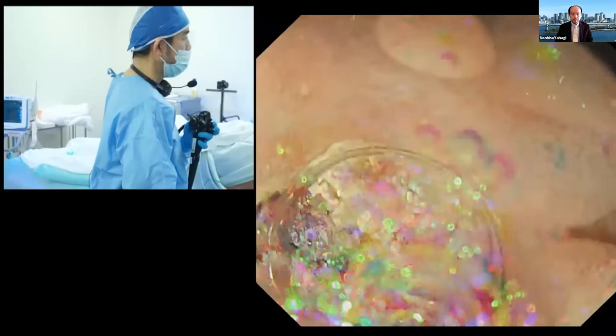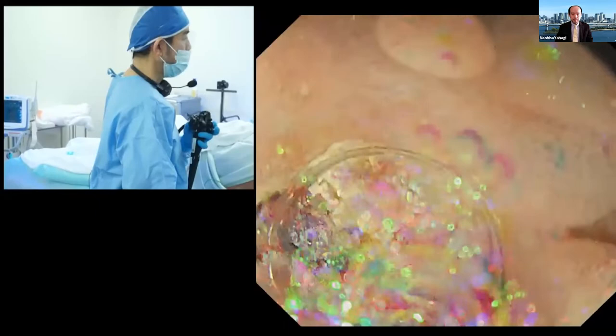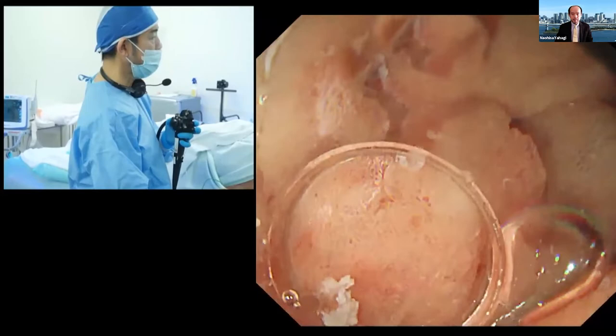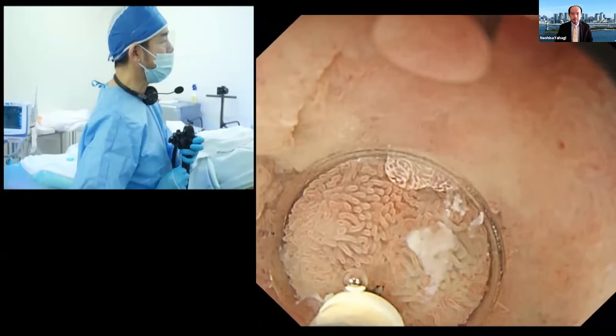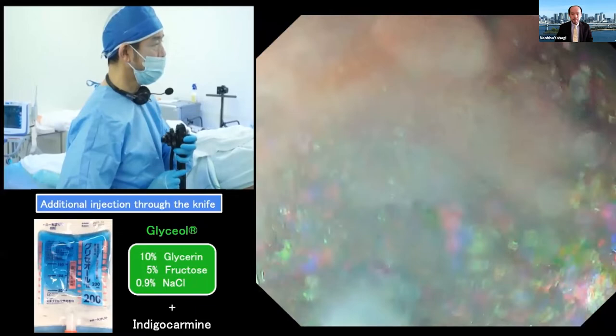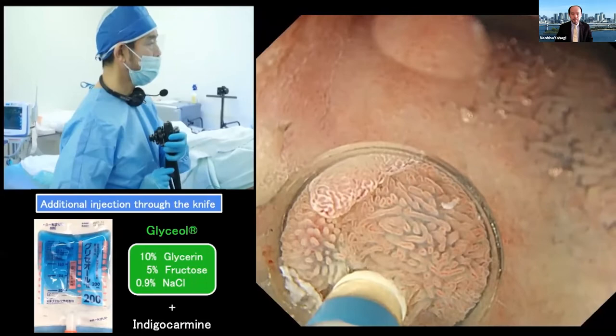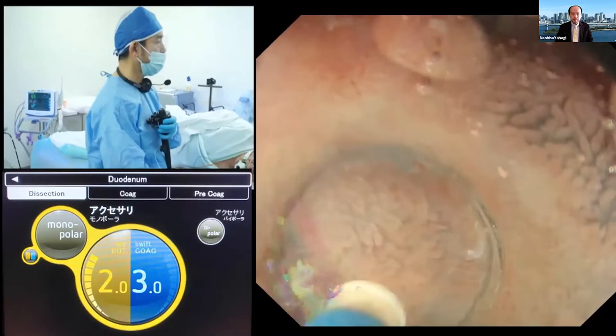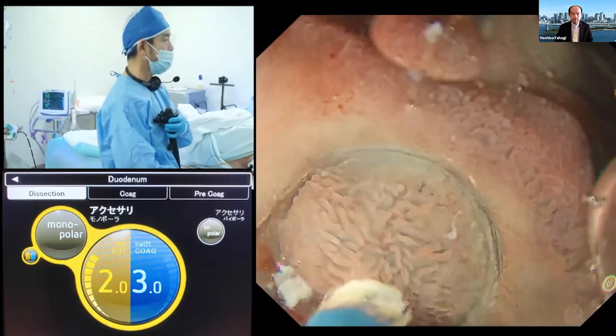Then I extend the mucosal incision to the lateral side, gently touch the mucosa and make a small hole, then ask my assistant for additional fluid cushion injection. Now it's nicely lifted up and I can conduct mucosal incision from here. Using dry cut mode, I gently control the endoscope to the right side by turning my wrist. The movement of my wrist is minimal, but still I can control very well. By hooking the edge, I can extend the mucosal incision to the oral side.